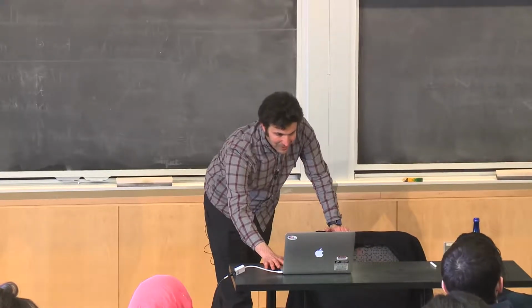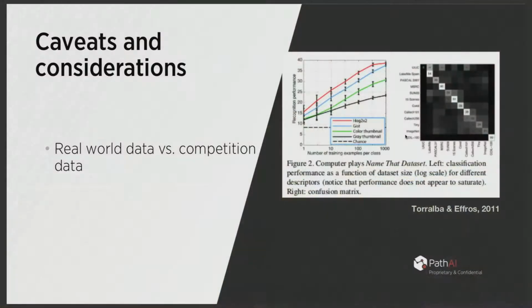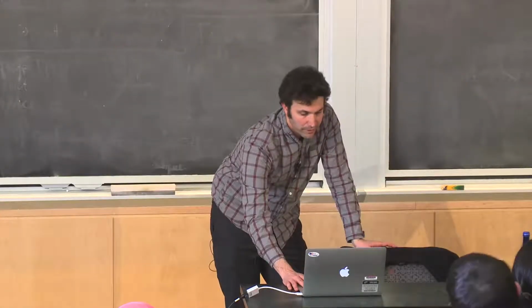So I kind of made a reference to this, but any of these computational data sets are relatively easy to get really good at. People have shown that you can build models that just predict a data set. Deep learning is almost too good at finding certain patterns and can find artifact. So it's just a caveat to keep in mind. We're doing experiments on lots of real world testing of methods like this across many labs with many different staining procedures and tissue preparation procedures, to evaluate the robustness. But that's why competition results, even ImageNet, always need to be taken with a grain of salt.